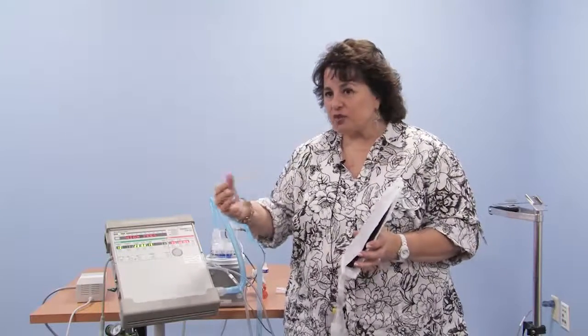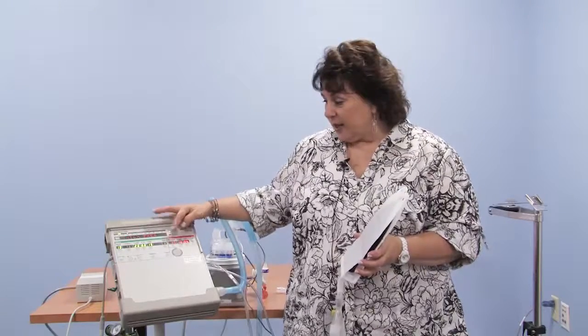And many families do for children that are very active, so that if the child just rolled over in bed and created a high pressure situation, they won't receive the high pressure alarm until the pressure goes over 35, which is where the alarm is set for this child.